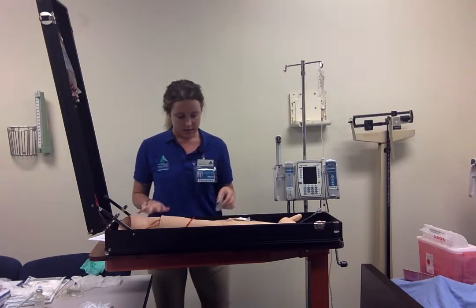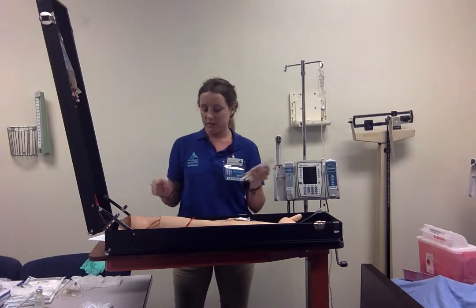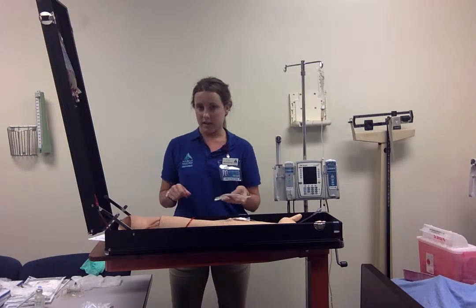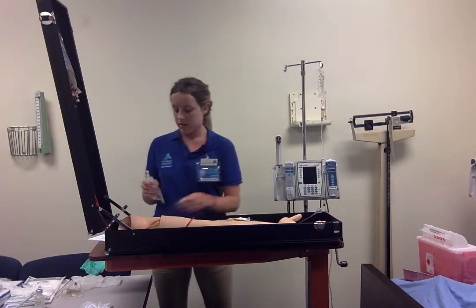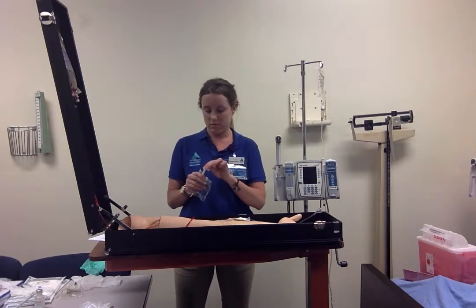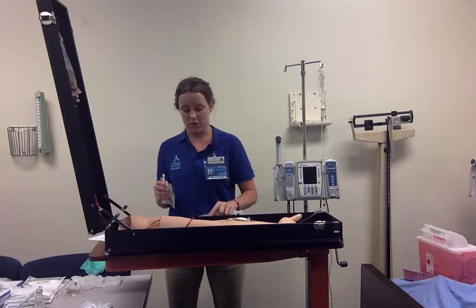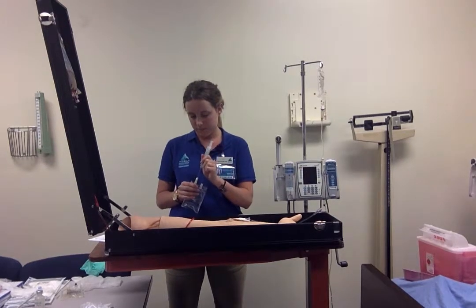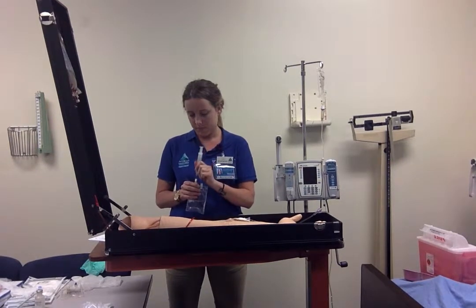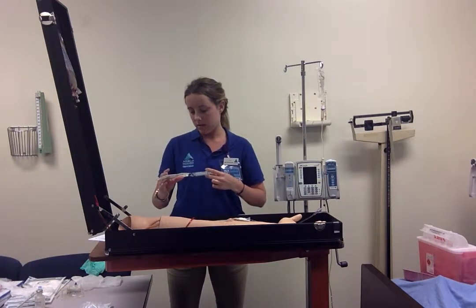And now I'm going to grab my piggyback, the sodium chloride mini bag, and I'm going to make sure I have a clean port. And I'm going to inject the medication inside the bag.